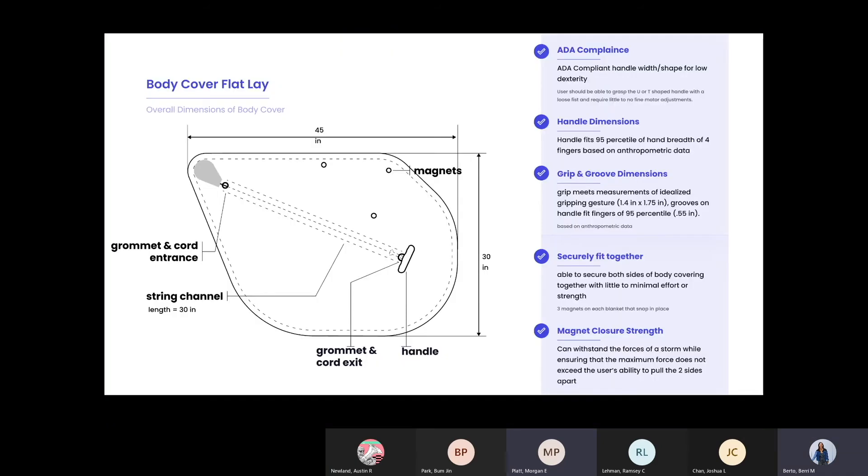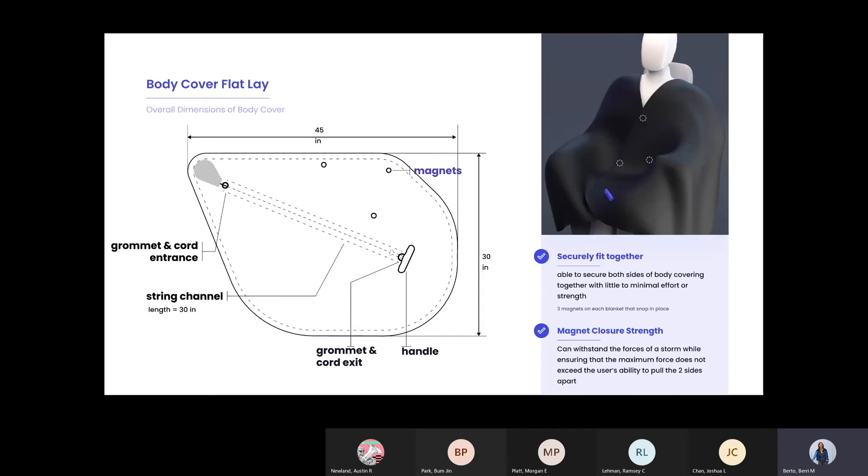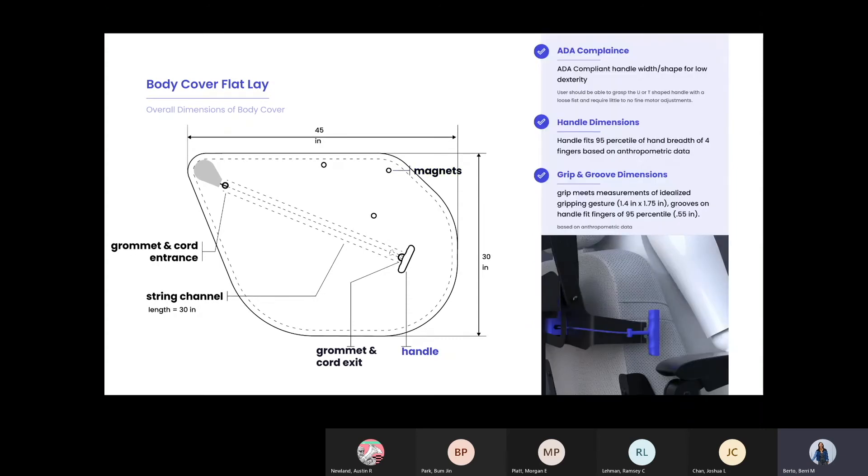Here you can see our body cover flat lay. We wanted to give you a better understanding of the location of the features on the body cover. So here you can see the overall dimensions, the magnet location, and the handle, which is secured into the channel with grommets, and where the pulley sits on the material. The key thing to note here is the channel, which allows us to meet our spec of the fabric fully extending when the handle is pulled.